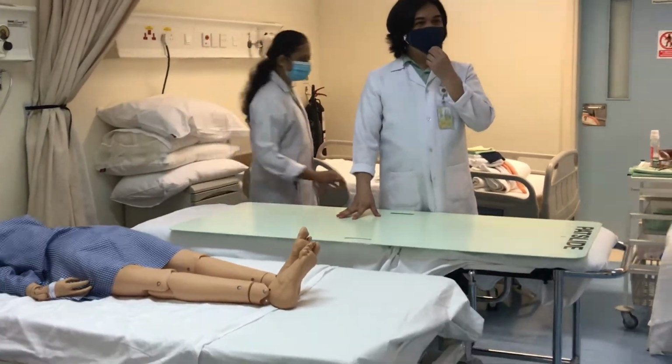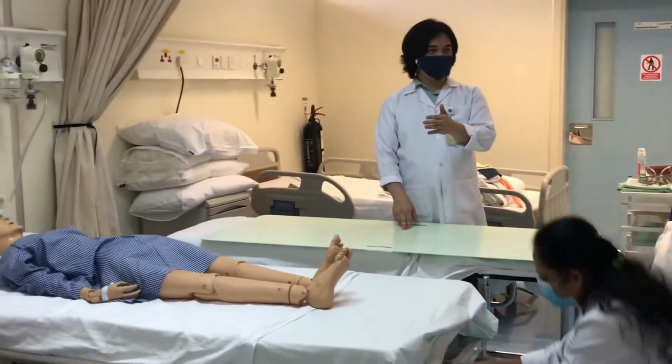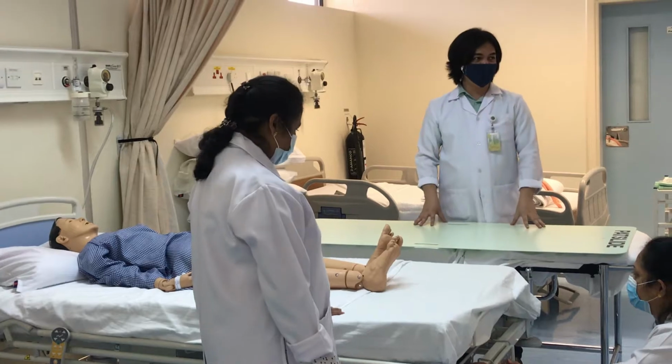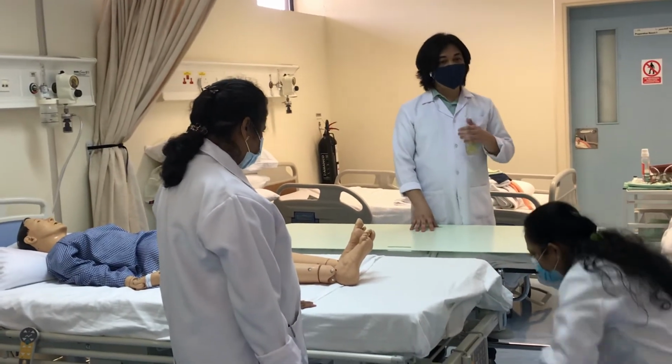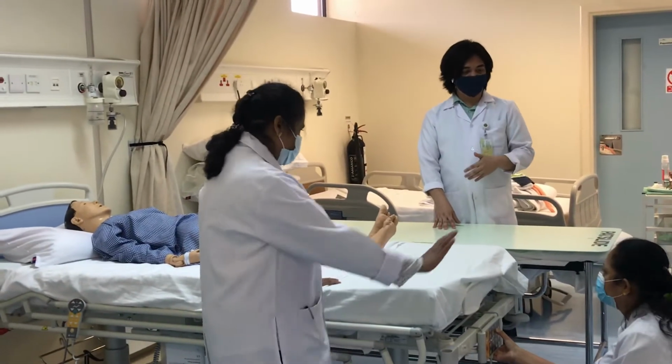Okay, transferring the patient from the bed to stretcher. If your patient cannot sit, or the patient is very weak and cannot use the wheelchair, we have another option. We have the stretcher. Especially in the hospital, if you're going to transport the patient into other section like operating room or other section, use this one.